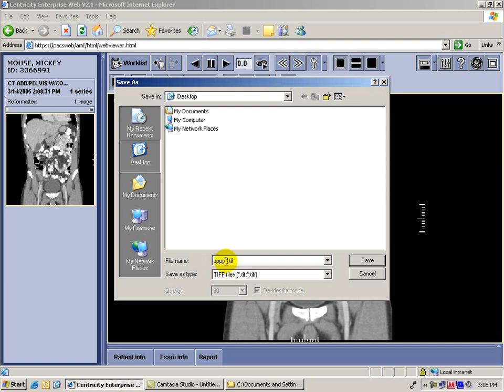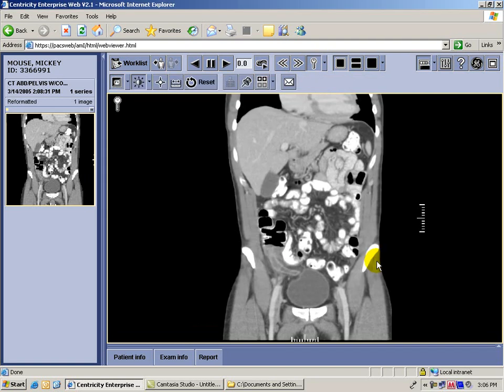You want to make sure that you give it a name — 'appy1,' for example — so that when you use other images, you can call them 'appy2' and 'appy3.' Again, this is a TIFF file. You click save, and you're done. That's how you get your highest quality image off of PACS.